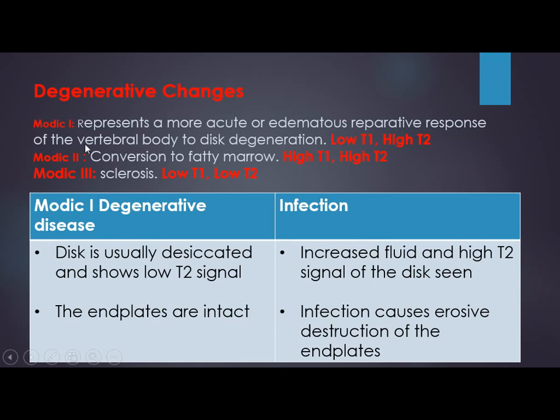Degenerative change of the spine follows the Modic classification. Modic 1 is edema and reparative process — it appears low T1, high T2. Modic 2, when there is conversion to marrow fat — high T1, high T2. Modic 3, when it becomes sclerotic — low T1, low T2. Sometimes there is difficulty differentiating Modic 1 from infection: in Modic 1, the disc is usually desiccated — dry with low T2 signal — while in infection there is increased fluid and high T2 signal of the disc. In Modic 1 the endplates are intact and regular, while in infection there is erosive destruction of the endplates.